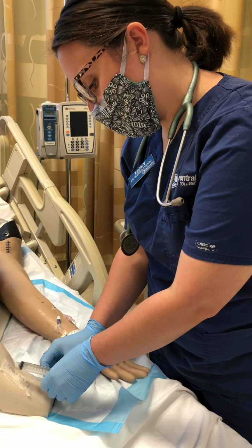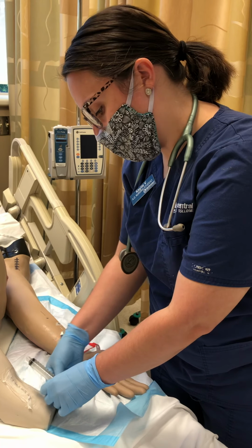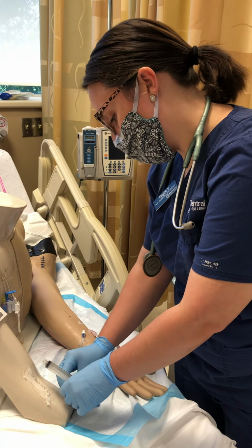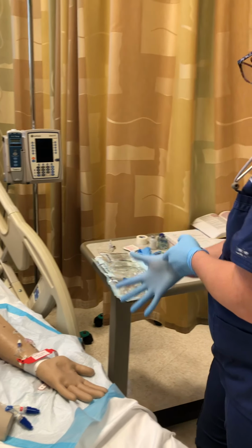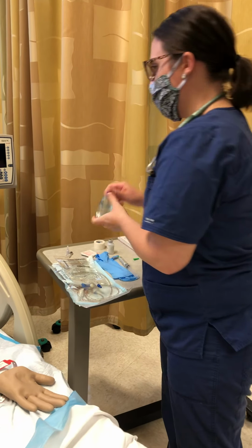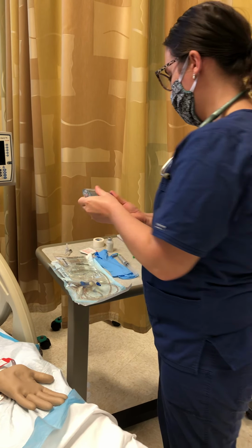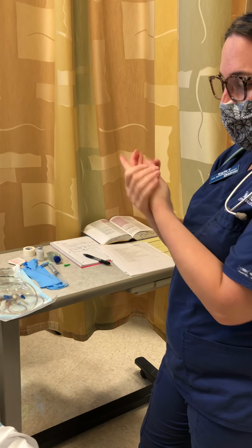I would clamp this because it's appropriate and it's part of my facility protocol. So that's clamp. Put that away. Wash my hands. Monitor my patient for any adverse reactions.